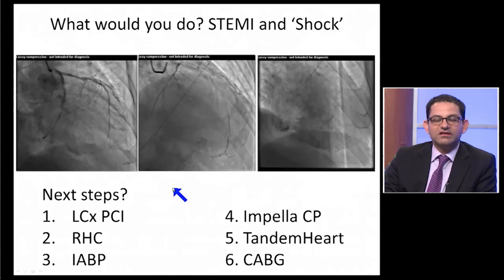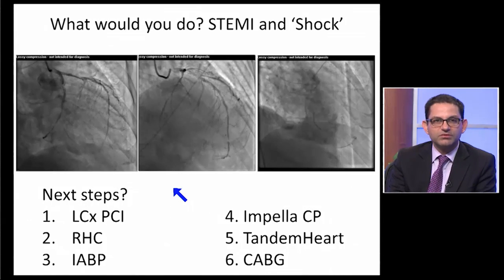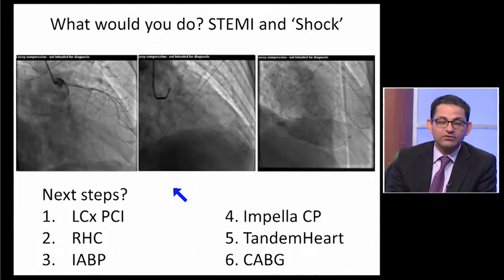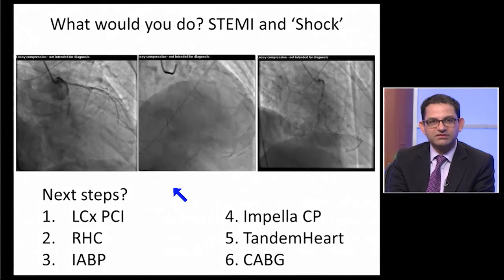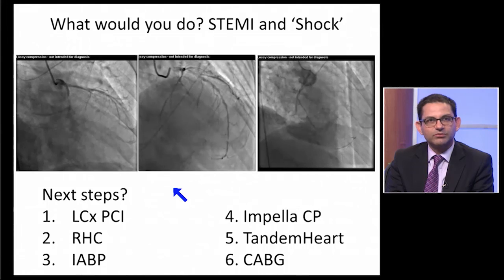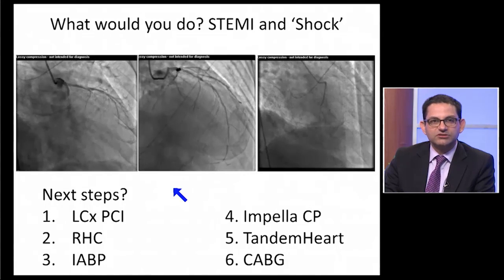So in our cath lab discussion, our next step was whether we should just quickly open up this left circumflex. Jeff mentioned doing a right heart cath. Should we think about going on support right now in this particular patient? By our clinical intuition, we think that this patient is headed in the wrong direction. If you go back to the slide we had showed about impending hemodynamic compromise with a reducing mean arterial pressure as this patient slides deeper into cardiogenic shock.